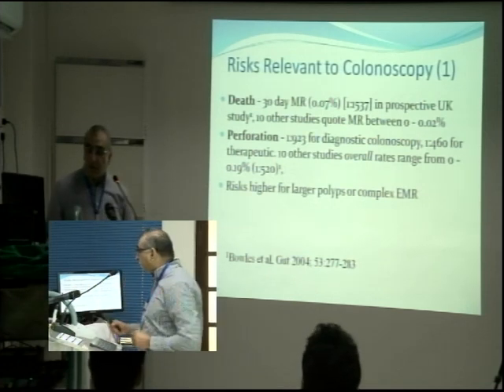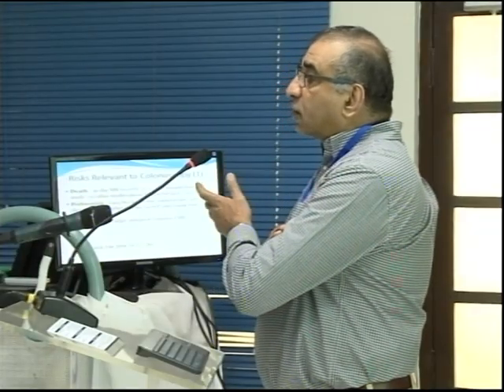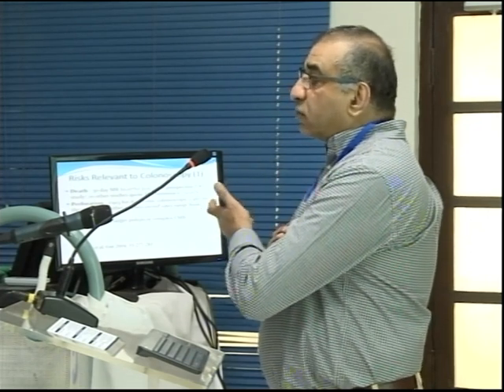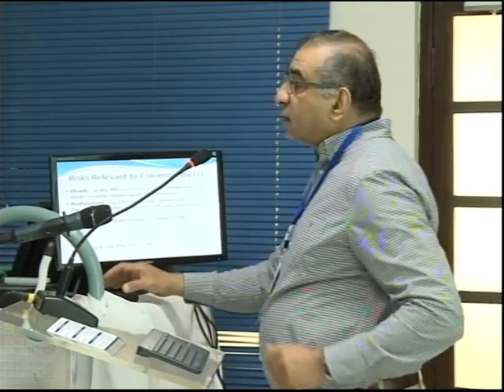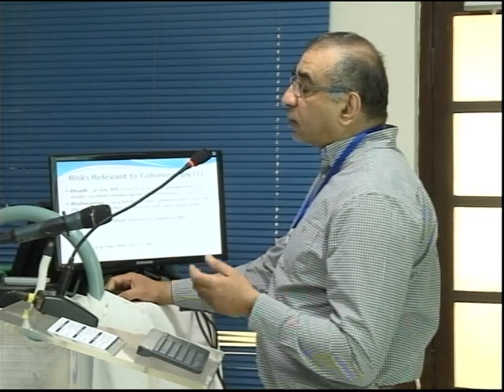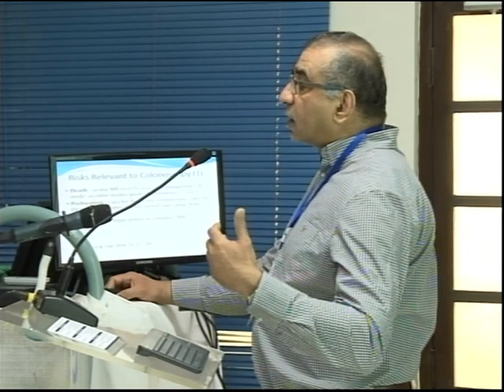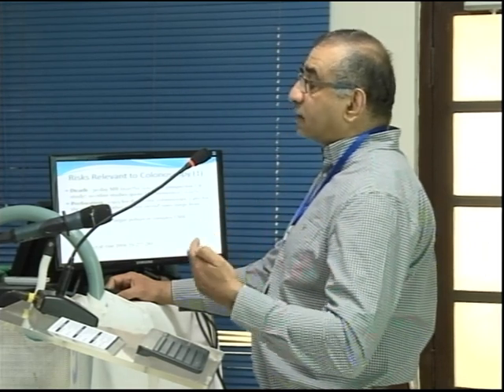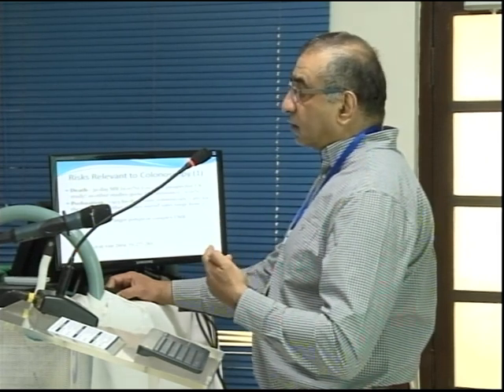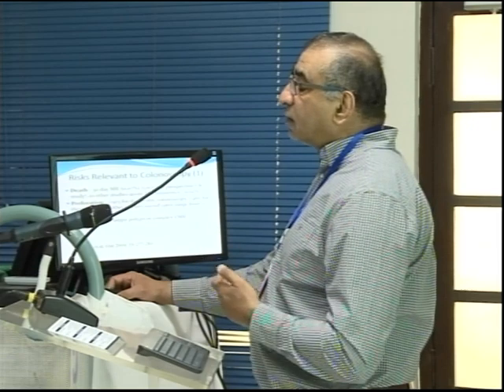complications of colonoscopy. Like any invasive procedure, colonoscopy has got potential for complications. And obviously, whenever you carry out a procedure like that, there should be sufficient justification to carry it out. One shouldn't carry out any procedure without due indication. One of the things I would like to mention at the outset is that abdominal pain is not an indication for colonoscopy because you do not gain anything out of it, right?